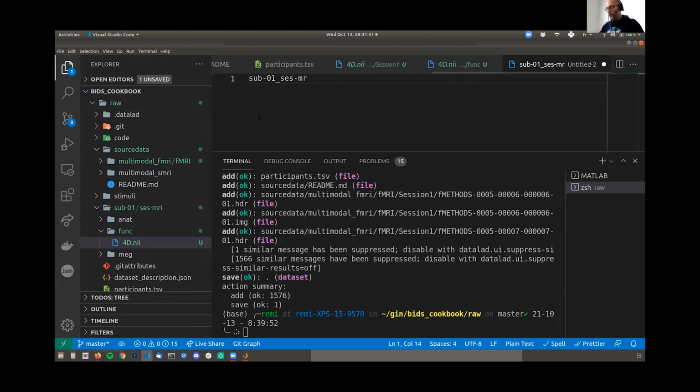You need to use a task entity to say what the people did, and they were seeing faces in this data set. It's a dash, not an underscore. Then this was the first run of a 2-run session. Then you use the suffix bold because you're dealing with bold data, and then you have the NIfTI extension. So this is how you would construct it.